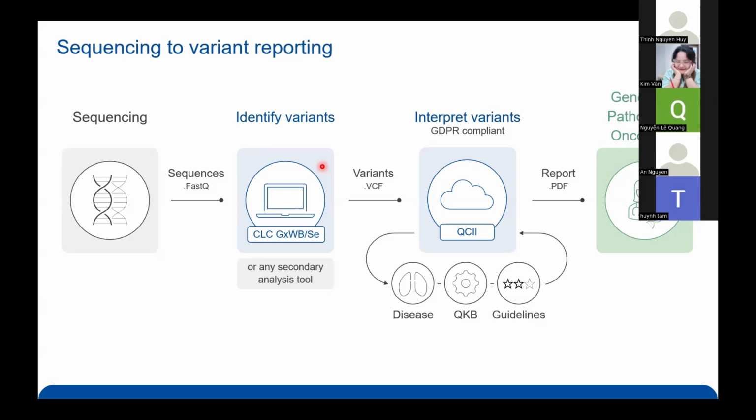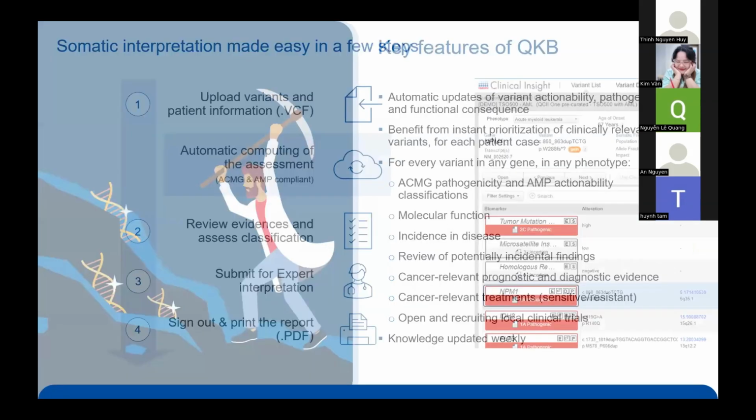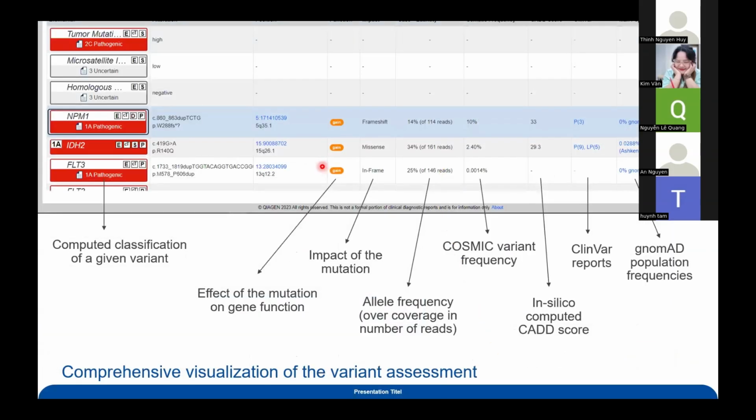You said in the nearly last line that you are waiting for the IVD for the software. So is the IVD for cancer diagnostic only, or for every line? Cancer only. Yes, we already have IVDR certification in Europe. As I think Tanat was also mentioning, each country has different rules and regulations, and we have followed the compliances of Europe. QCI, especially for somatic, has got the IVDR certification in Europe.